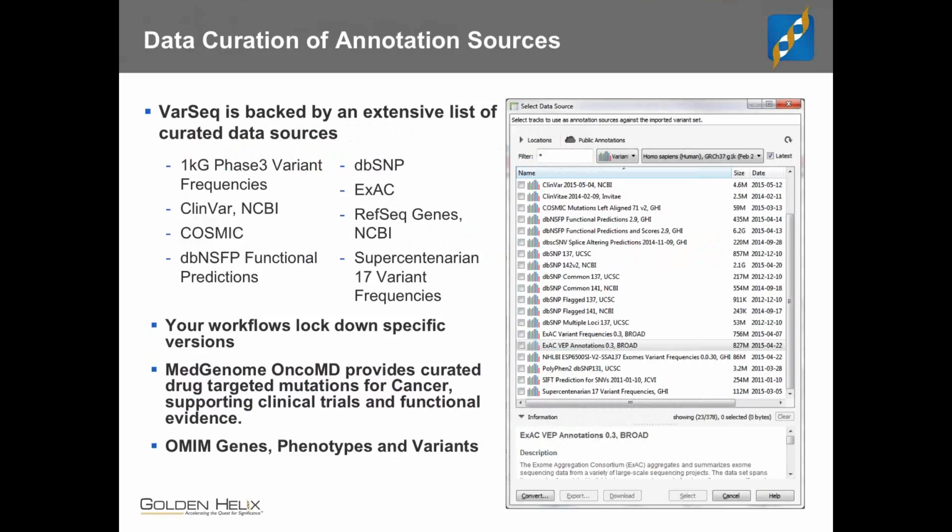Now, some of our sources are updated fairly often, like ClinVar and OMIM are updated on a monthly basis. So you can see that information can change from month to month as those data sources get updated. And so we don't automatically update those sources in your VarSeq projects, but we do give you the opportunity to update as those updates become available by giving you a little update button. So we make that easy for you.